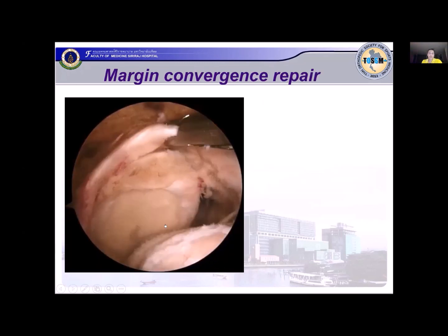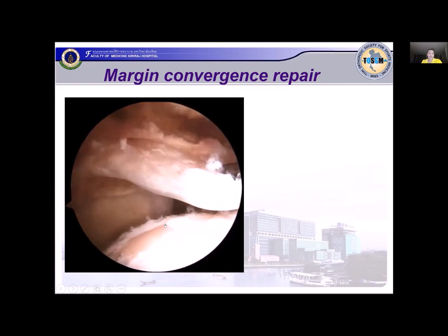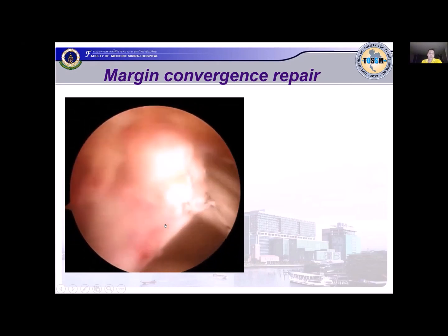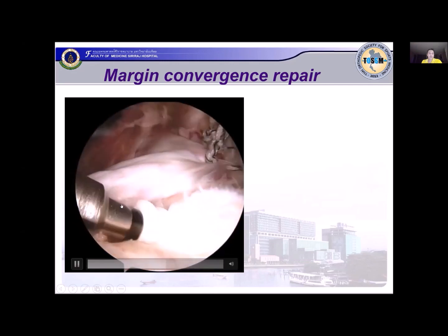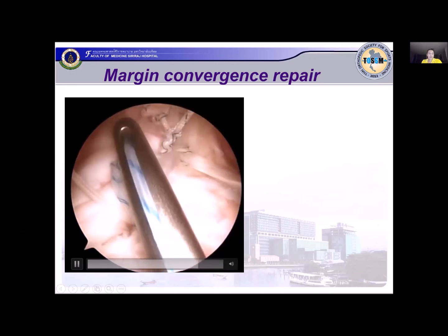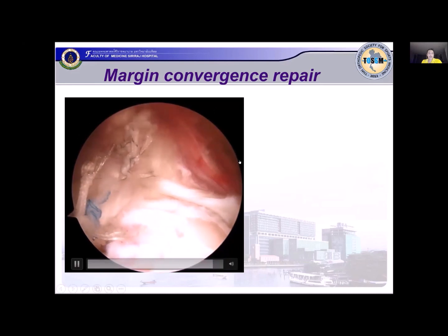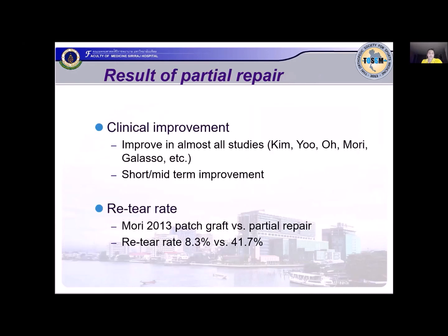This is how margin convergence repair was done. If we pull the tendon, we cannot reach the footprint, so we tie it at the apex, making it side-to-side, and fix at the back and in the front. But the thing is, we have a defect here at the apex of the tear, like this. Anyway, I think the clinical improvement is quite good. Many papers mention good short and mid-term improvement, but the retear rate is about 40%.